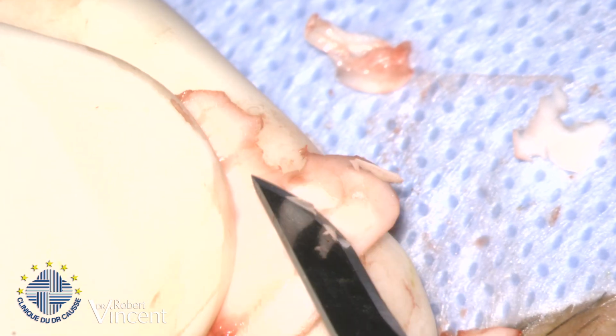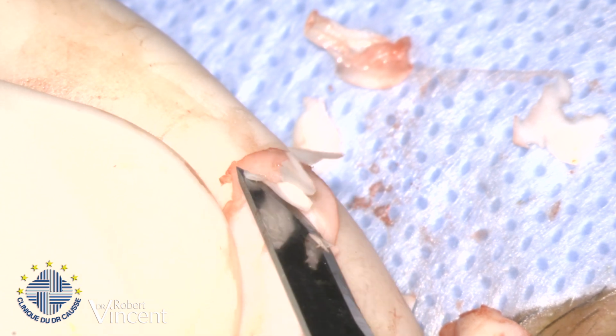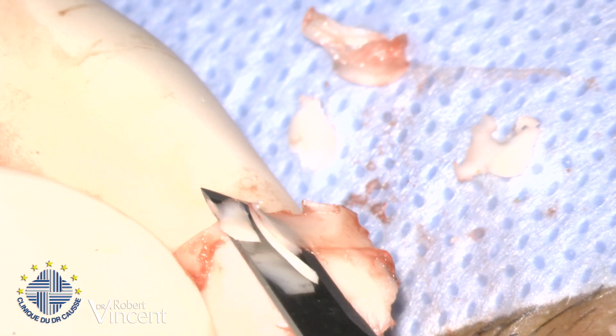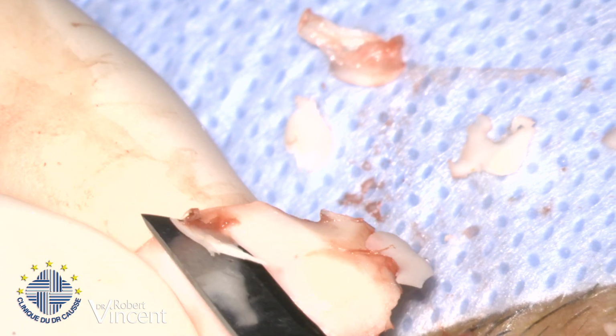So we need to have it. I don't like when it's too thick because it impairs the mobility of the tympanic membrane. I've seen many cases where I was revising cases where the previous surgeon was using cartilage interposition and didn't even trim it, and it was so thick. It's not so easy then to remove it when you revise, because it sticks to everything, to the prosthesis. Yes. And if you keep a little bit of connective tissue from the lateral side, you can exactly know the limit of the trimming.